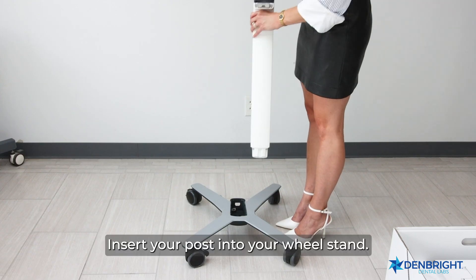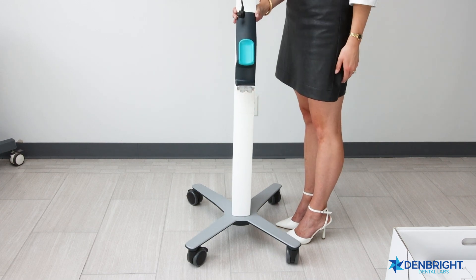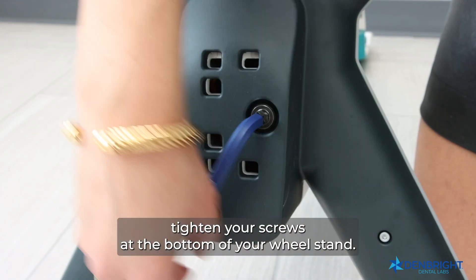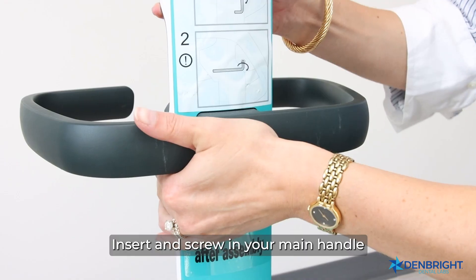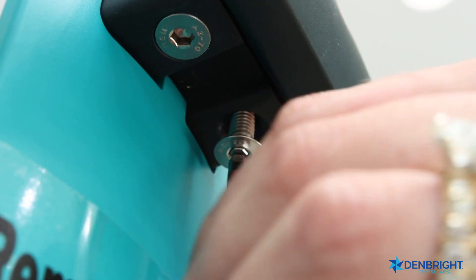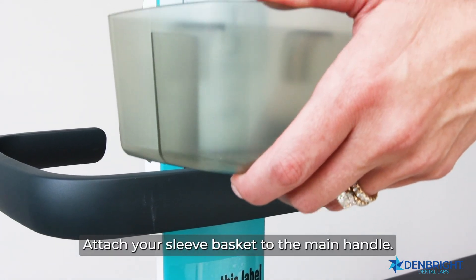Insert your post into your wheel stand. Using the blue Allen key, tighten your screws at the bottom of your wheel stand. Insert and screw in your main handle, found in your accessory box, then attach your sleeve basket to the main handle.